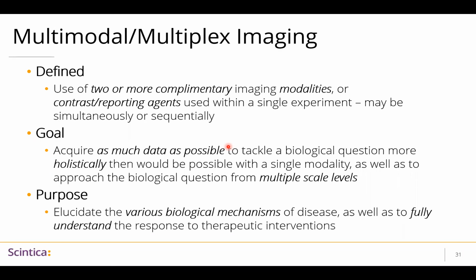So the goal here is to acquire as much data as possible to track the different biological questions in a more holistic approach, which would not be possible with a single modality. So we want to approach every study that we do to acquire as much data as possible from that animal.